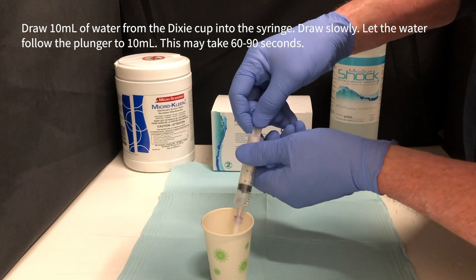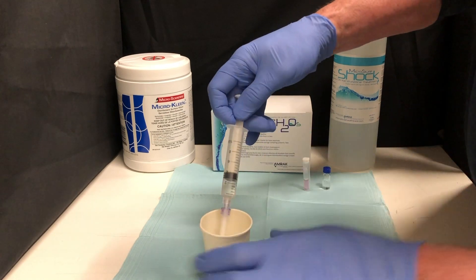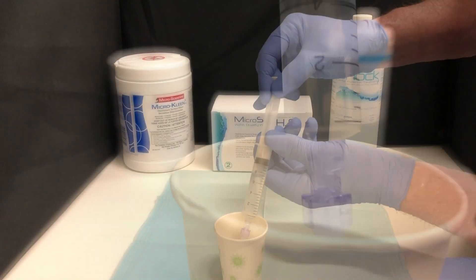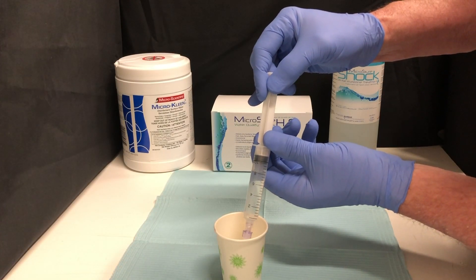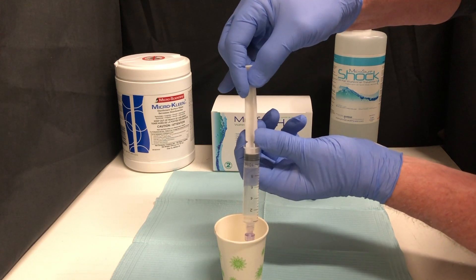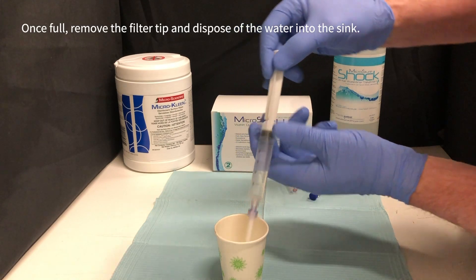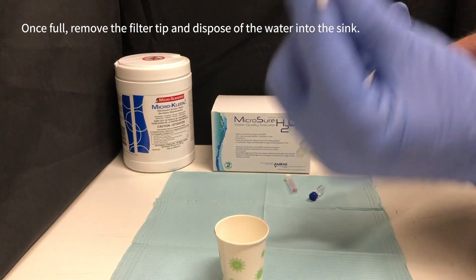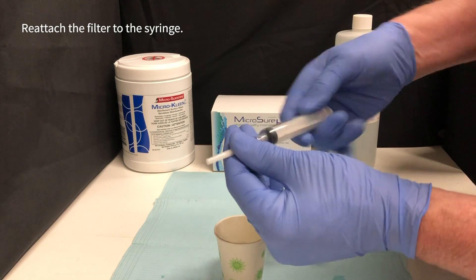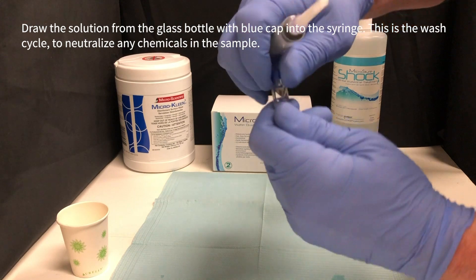Let the water follow the plunger to 10 milliliters — this may take 60 to 90 seconds. Once full, remove the filter tip and dispose of the water into the sink. Reattach the filter to the syringe.